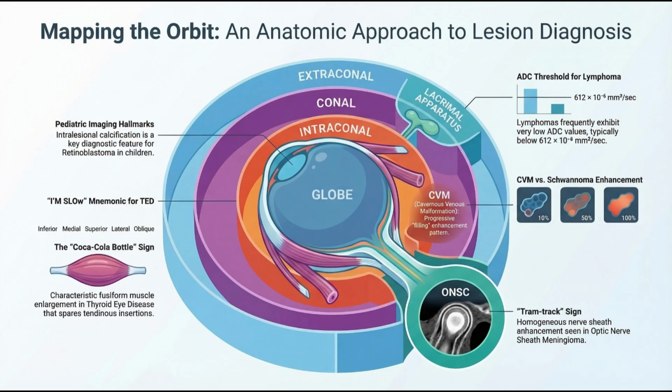Infantile hemangiomas are benign, and they are quite common. They are essentially disorganized tangles of rapidly growing blood vessels. And they shrink on their own, right? They have a very predictable life cycle. They grow quickly in the first few months of a baby's life, and then they naturally shrink and fade away over several years. And on an MRI, because they are made of fast-moving blood, you see these empty-looking tubes. The blood is moving so fast, the scanner can't even catch the signal. They call them flow voids.